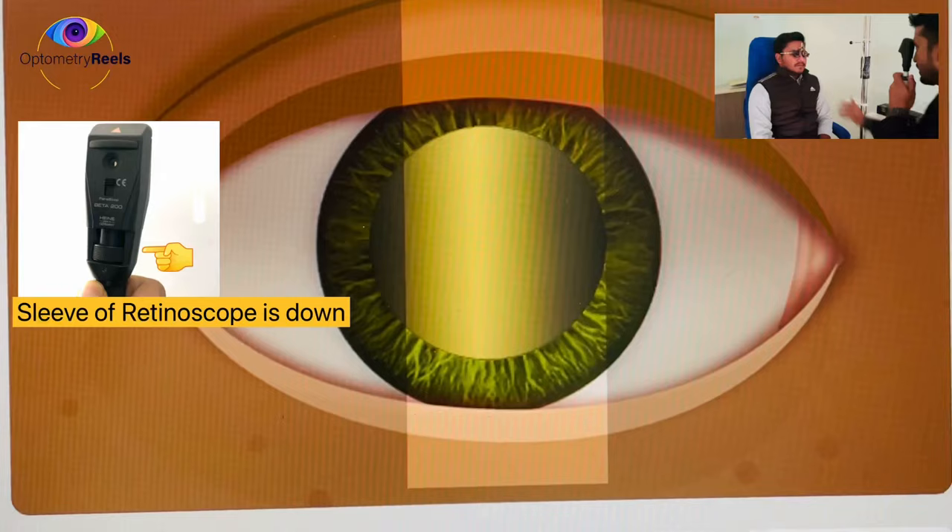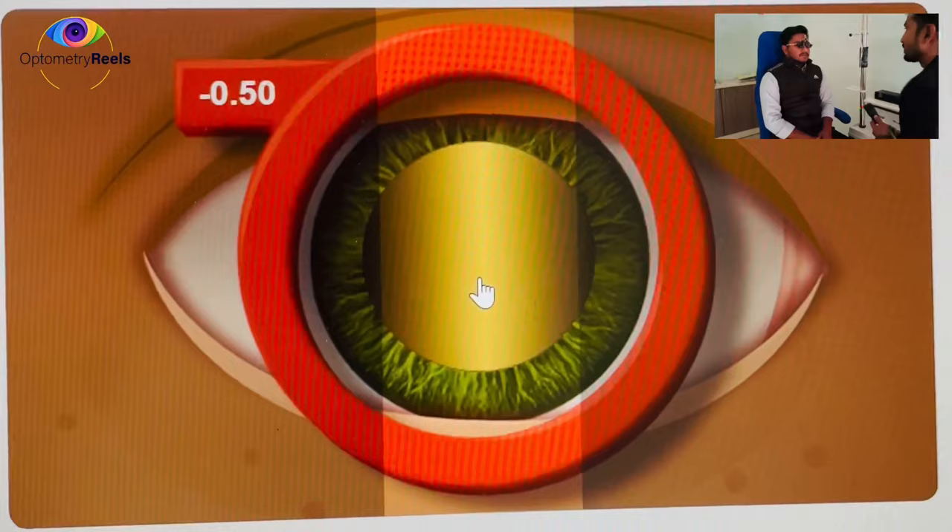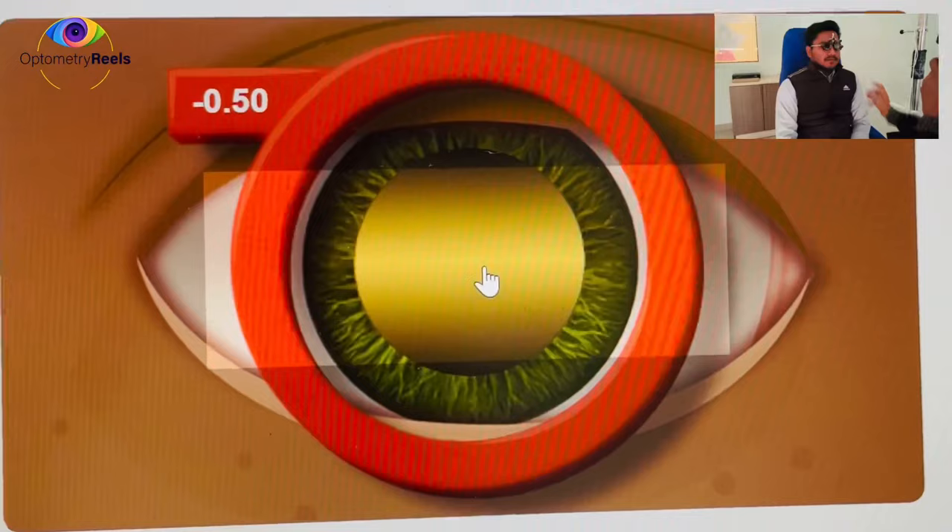I'll be performing retinoscopy on the left eye of the patient. The retinoscope is in my left hand and I'll be using my left eye, with both eyes open. I can see 'against' movement in all meridians — when the streak moves, the glow inside the pupil moves in the opposite direction. For 'against' movement, we use minus (concave) lenses.